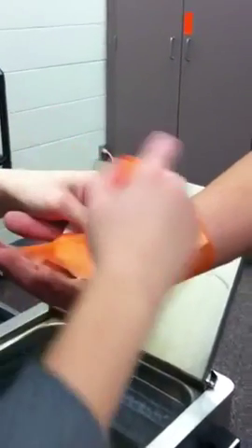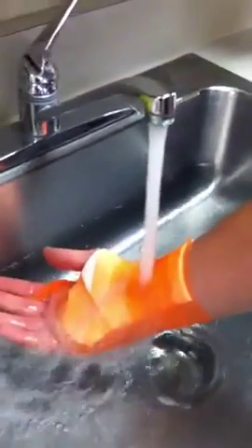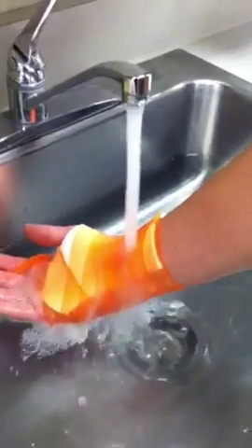And what we're going to do is we've got to harden this up, so we're going to walk over to a cold water sink over here. We're going to turn the water on. The patient's going to run it underneath the sink, and this is going to make it hard again and back into its original form.